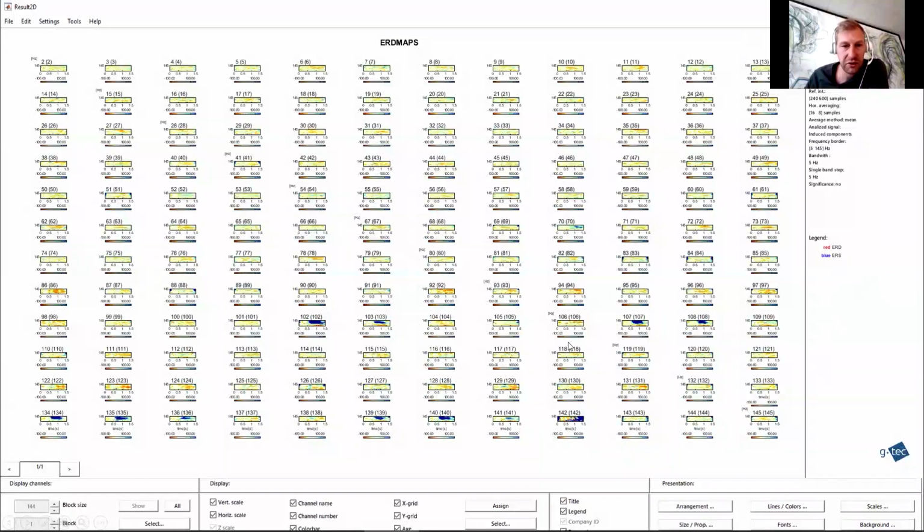This is a bit difficult to understand. What we already can see is that there are some blue blobs in some of the boxes. This is the high gamma activation. So there are some electrodes that are totally off and some electrodes that are reacting very much and showing brain activation for the visual perception. What we don't know is the detail of the TF map and also where it happens.